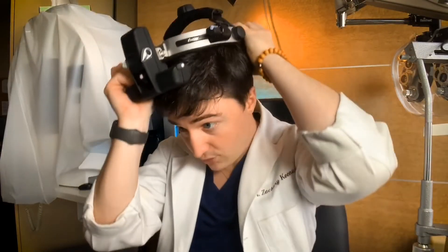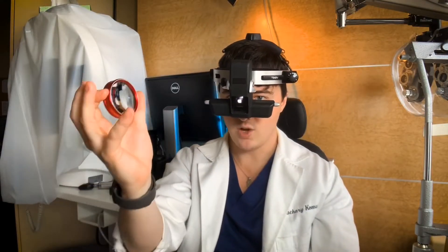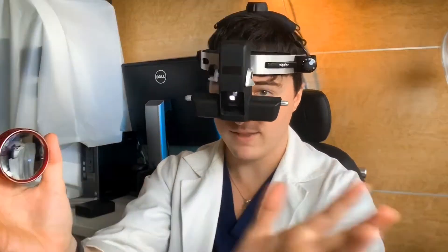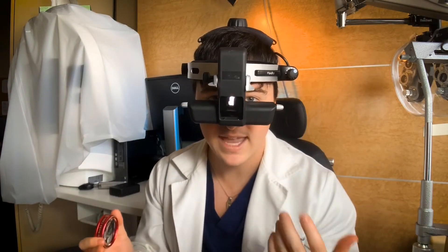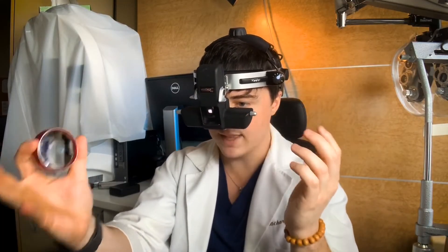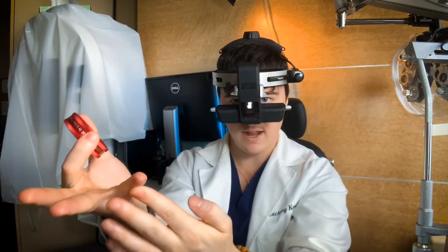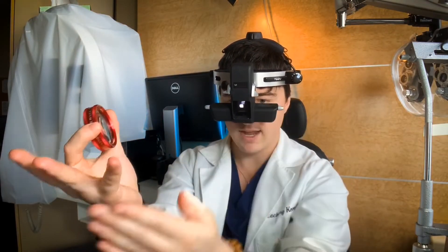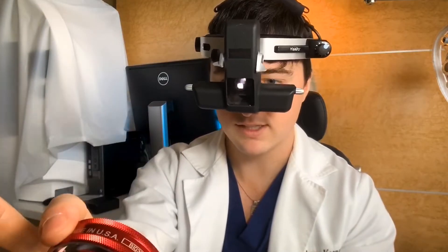First, with the indirect on but without the lens in front, get a red reflex. Shine the light directly at the pupil — which should be dilated by this point — and you'll see the red reflex coming back, kind of like a camera when you get red eye from the flash reflecting. Find that first. Have your pinky braced on their face and the lens out to the side, not in front of the eye. Once you've found the red reflex, bring the lens over in front of the pupil.